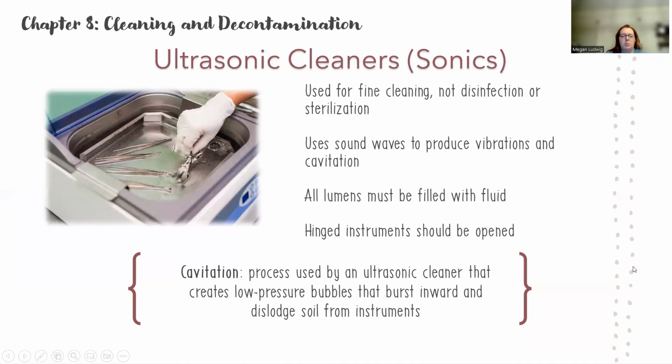So also in decontam, you have something called an ultrasonic cleaner. Sometimes they are referred to as sonics. This is used for fine cleaning, not necessarily for disinfection, definitely not for sterilization. And it's kind of unique in the way that it works. It's not just using plain water. You put it in this machine, and it's basically going to have sound waves put into the water that we can't necessarily hear, but it produces enough vibration to cause something called cavitation.